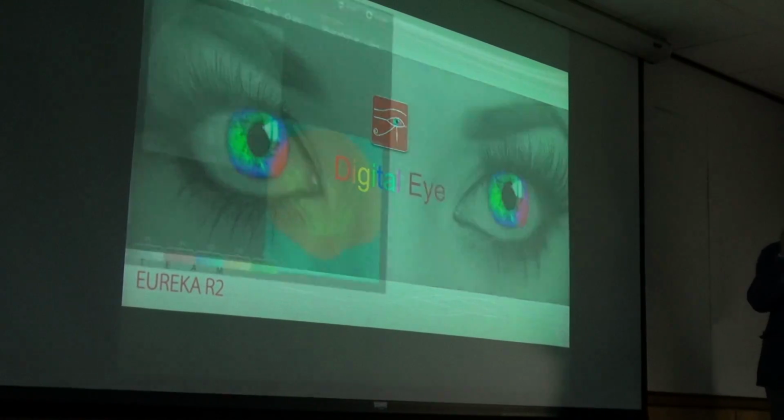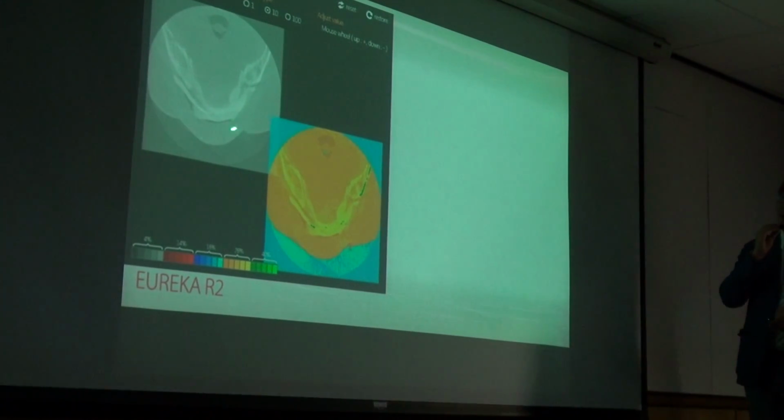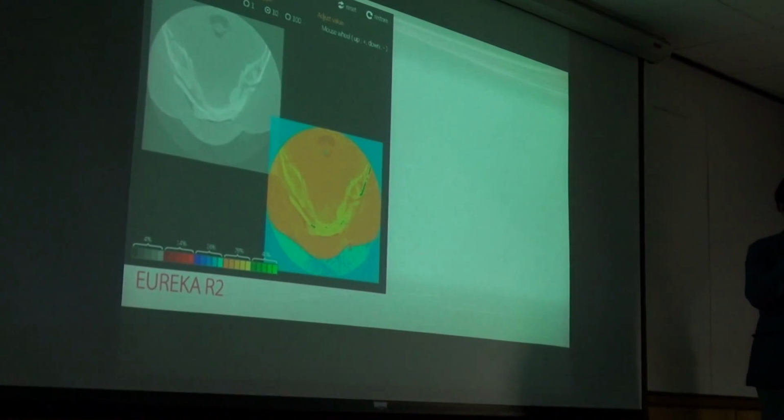It's very simple logic. The CBCT grayscale image is totally different, depending upon the machines. But this is digital data. So all of the digital data have their own digital values. So the most important thing is standardization, right?